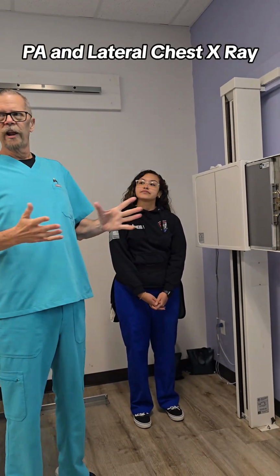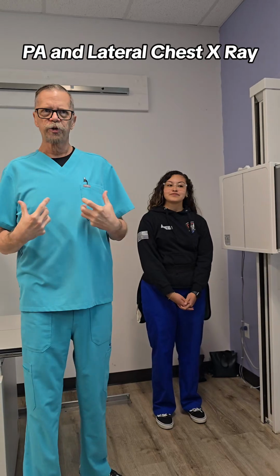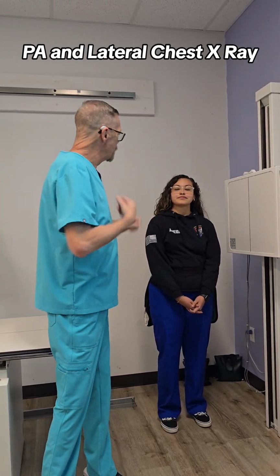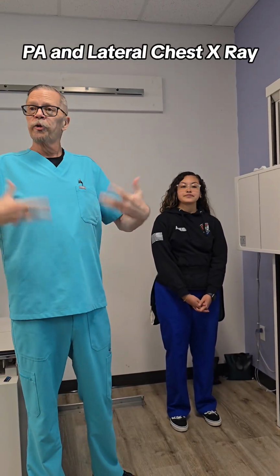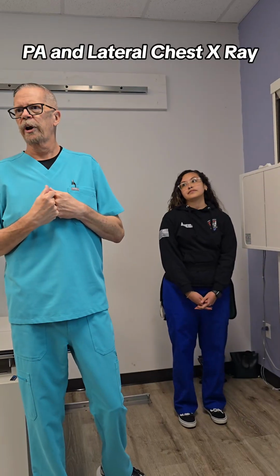Obviously, a lot of people comment in the videos, what about all the artifacts? We're not using real x-rays here. If this was a real x-ray, her necklace would come out. We would have the patient undressed from the waist up, put on a gown opening to the back, and then proceed with the x-ray.